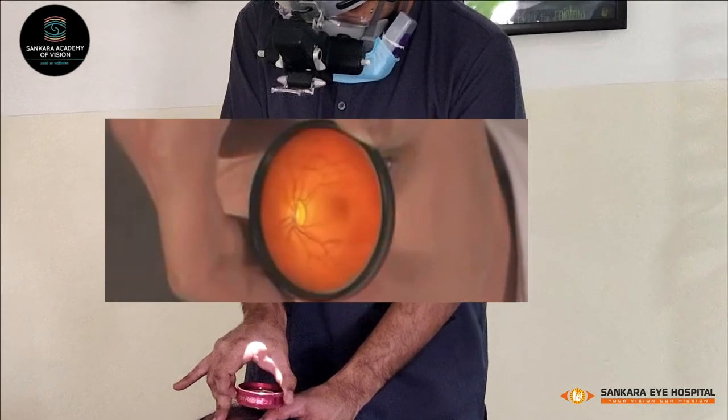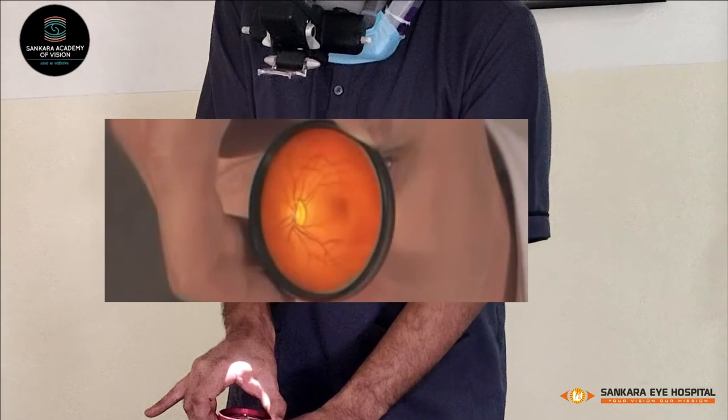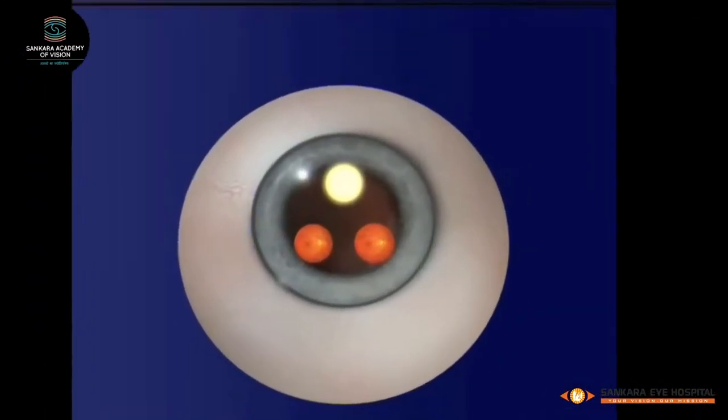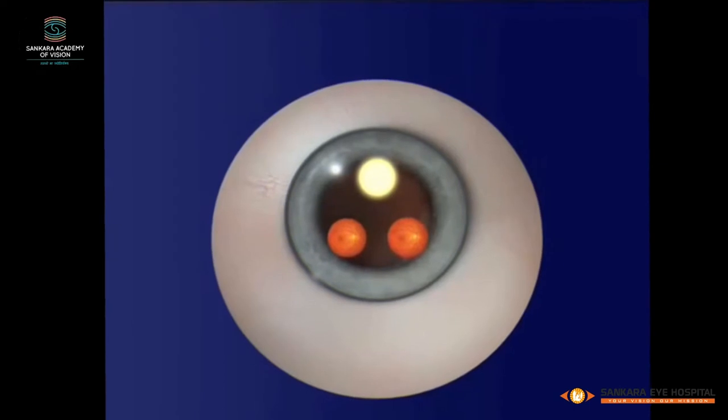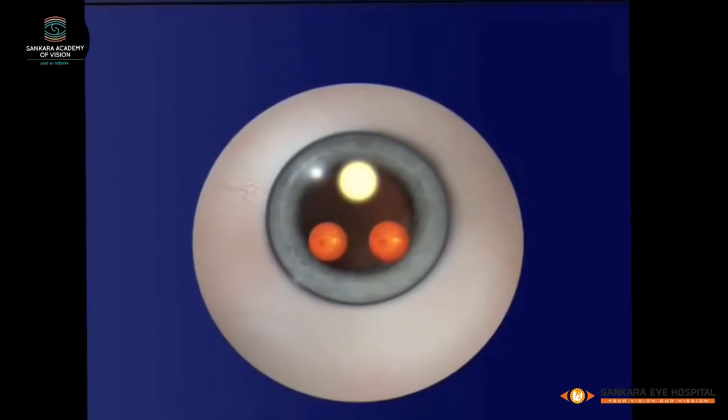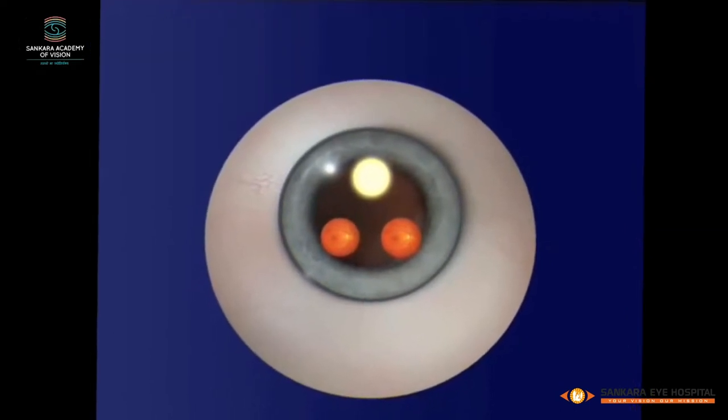This enables the stereoscopic visualization of retina. For maximum stereopsis, the patient's pupil must be well dilated to allow all three beams to pass through it.